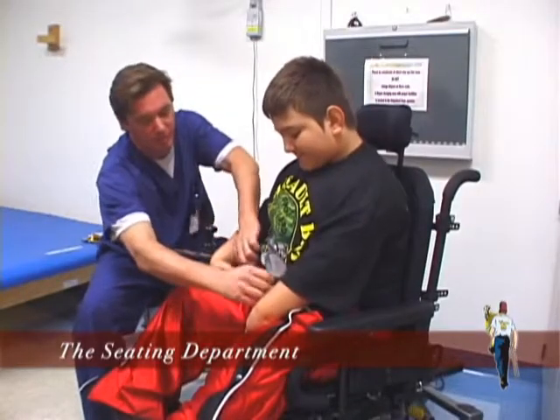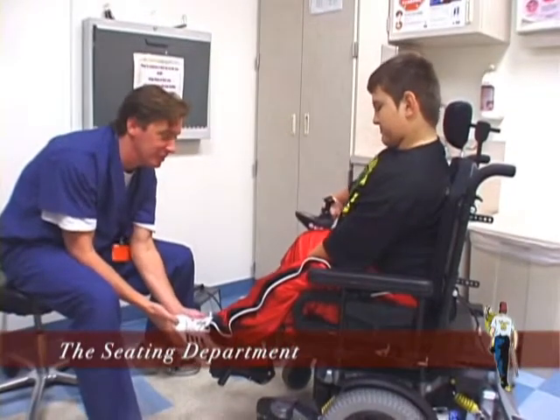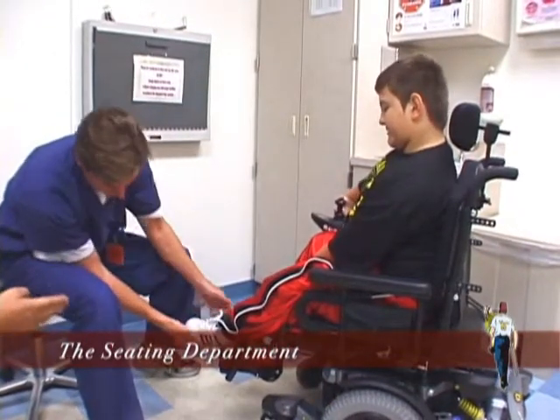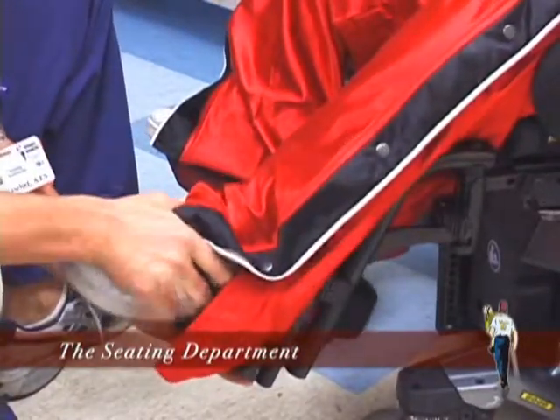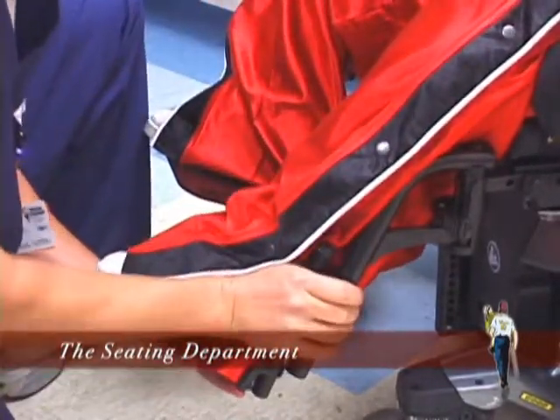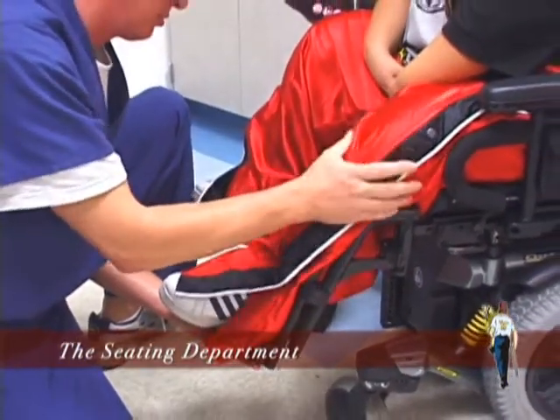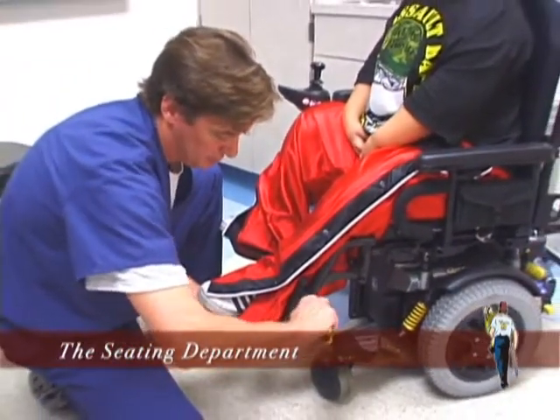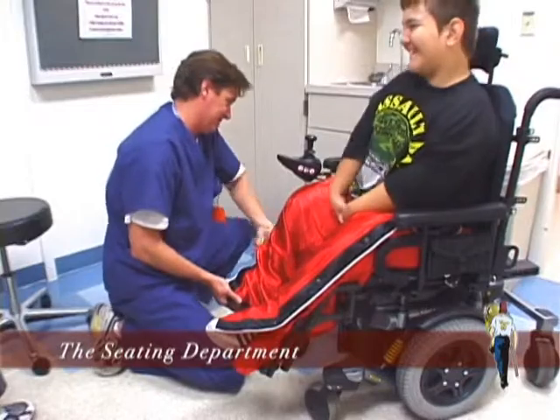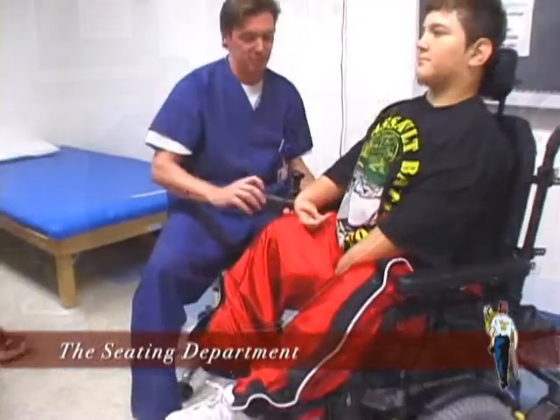We take care of about 1,500 kids that are full-time wheelchair users at this hospital on a yearly basis. The average custom wheelchair for a full-time user with a seating system that's appropriate can be anywhere from $4,000 to $6,000 per child. And this equipment does wear quickly. Children grow, so on a yearly basis at least there has to be modifications or changes. And for the most part these wheelchairs probably last around 4 or 5 years.